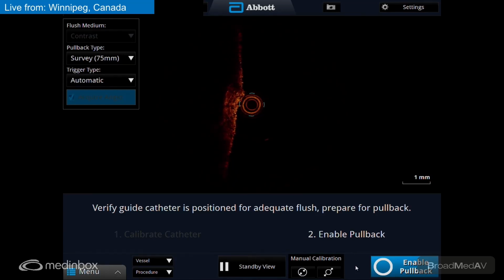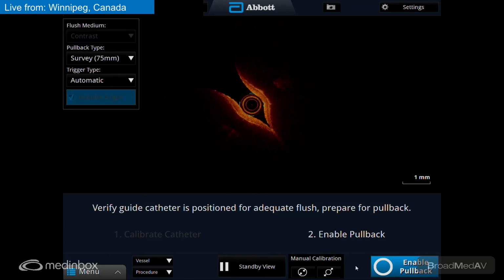That's wonderful. So that jump tells me that it's not actually an obstruction. It's a lot of guideliner metal interaction inside the artery. And what it'll tell us also is that because it's a bit of an ostial stent, likely we didn't traumatize our stent or accordion any bit of it.